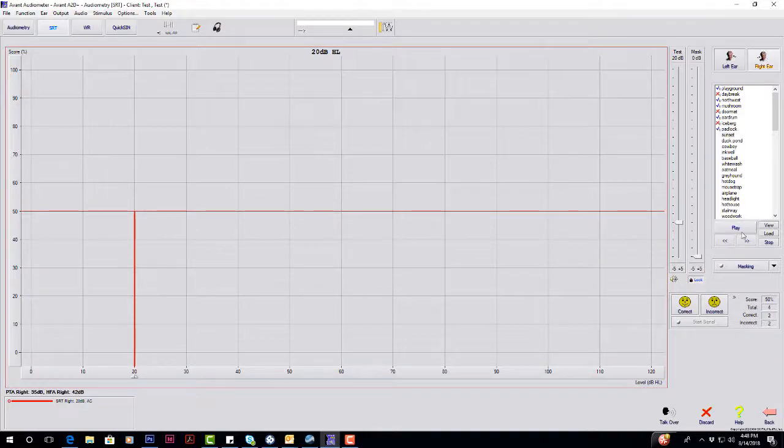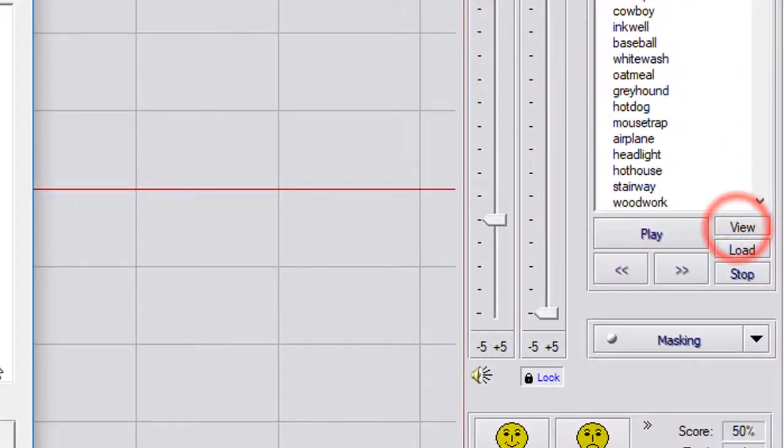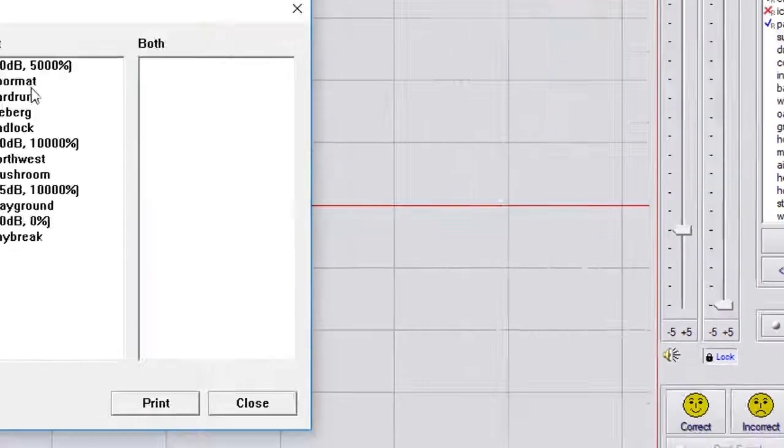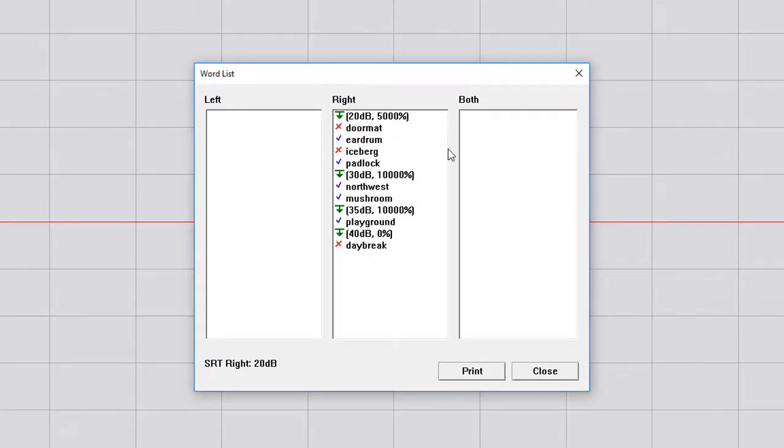You want to print this off. You can go to the View button here, and it's going to pull up the word list, what you got correct and incorrect. It's also going to give you your dB level and scoring.